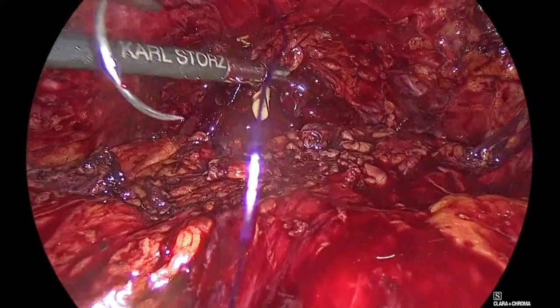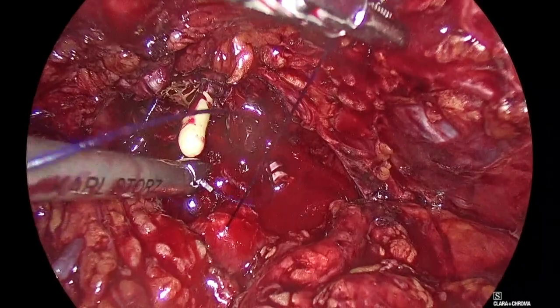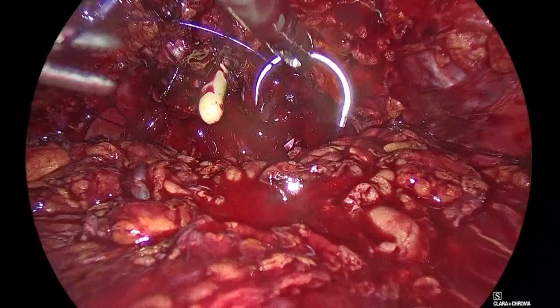Panayotis, just use your suction to slightly bring this. No, not here. Here. Correct. Good. Second pass on the bladder. Good. Leave it, Panayotis. I will need a tampon now from you to push under the urethra. Can you do it? Come, go back.